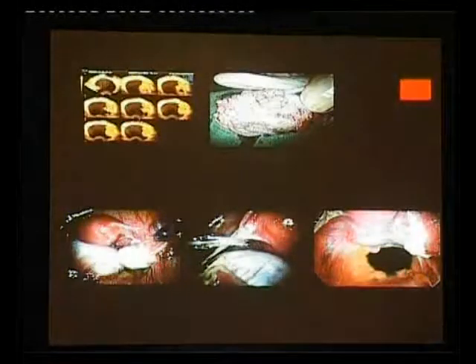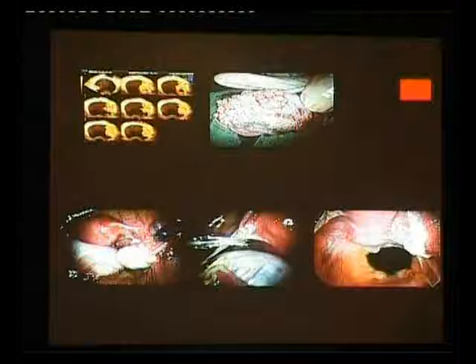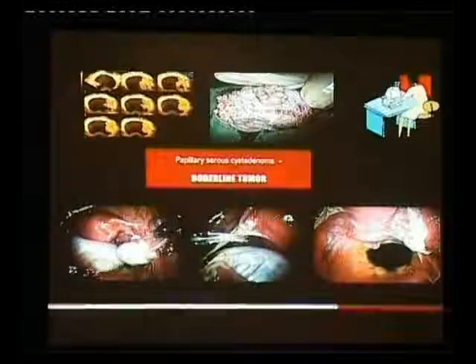Having done this, we did a laparoscopy for her. We did an ovariotomy because it was predicted as a borderline tumor, and she was already coming in for an egg donation program. And when we removed the mass, you can see the comparison to the ultrasound findings. It's really awesome to do a good ultrasound. And the histopathology showed a papillary serous cystadenoma with a borderline tumor.